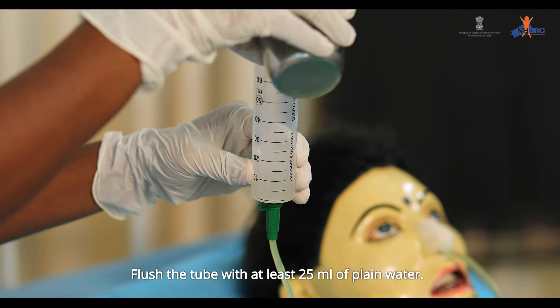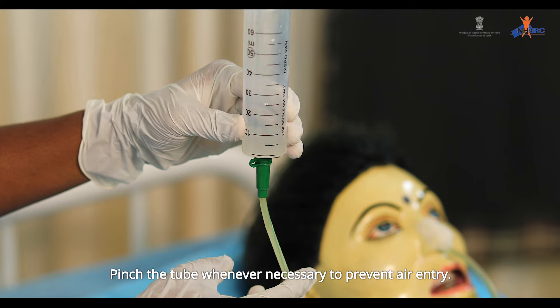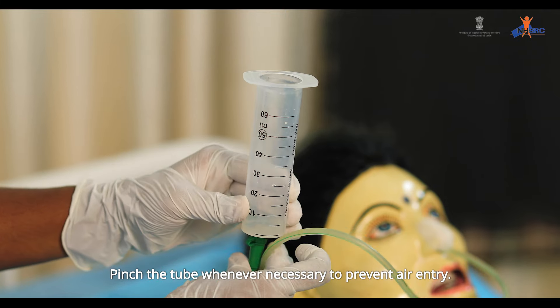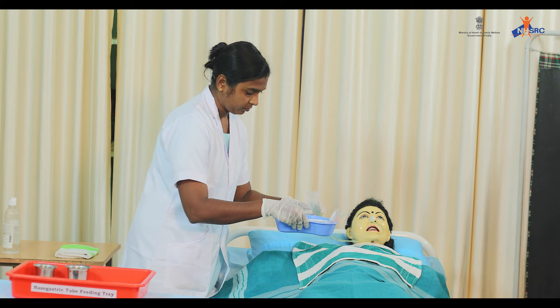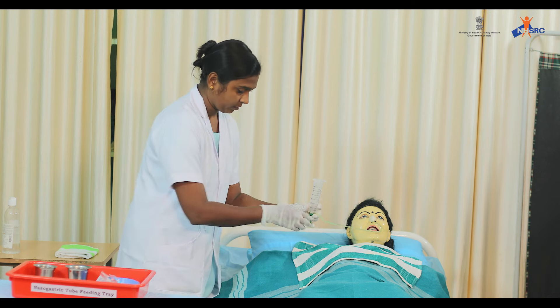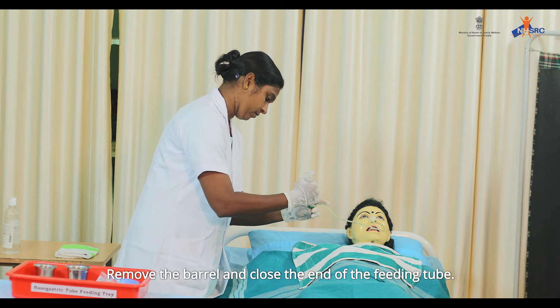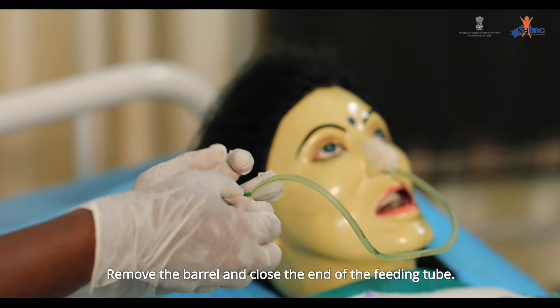Total quantity of feed plus water should not exceed more than 250 ml. Flush the tube with at least 25 ml of plain water. Pinch the tube whenever necessary to prevent air entry.